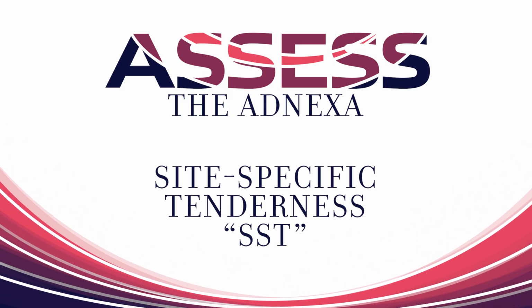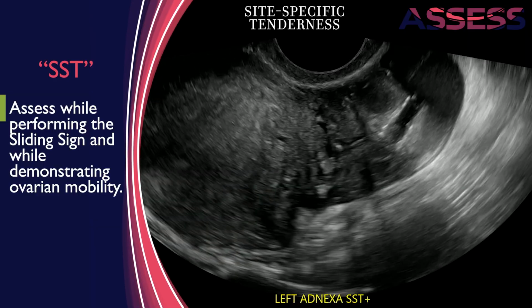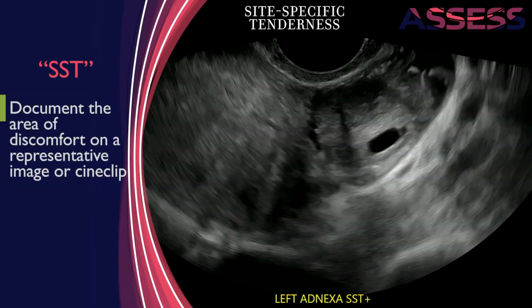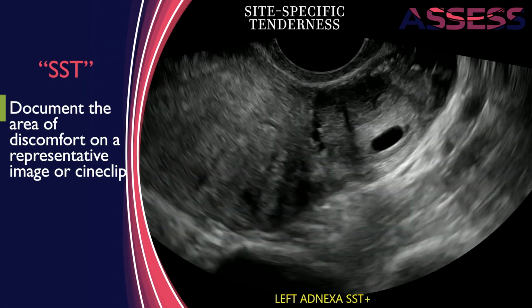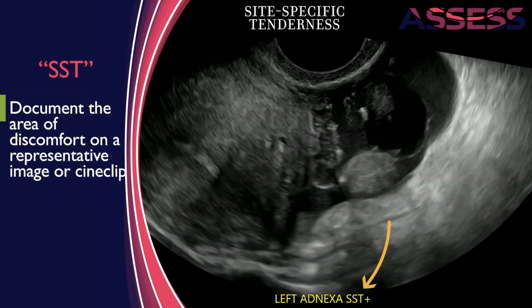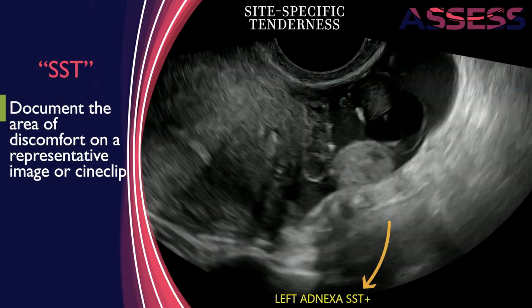Site-specific tenderness. During the acquisition of images and while evaluating mobility, it is important to document patient discomfort. If the patient is experiencing pain or tenderness in a specific area, it can be documented with the acronym SST, short for Site-Specific Tenderness, on a representative image.